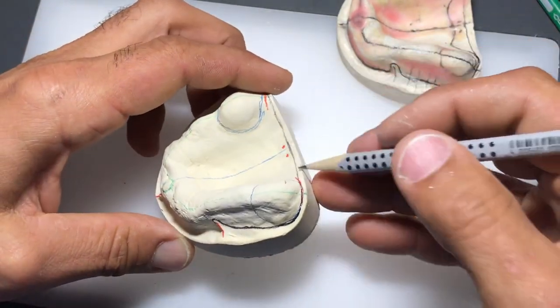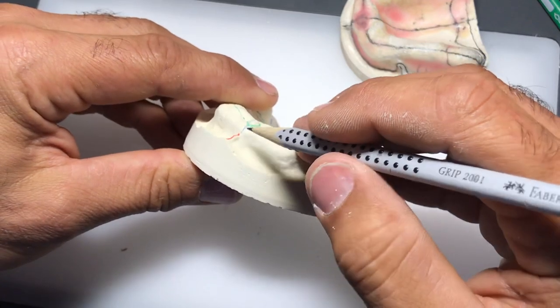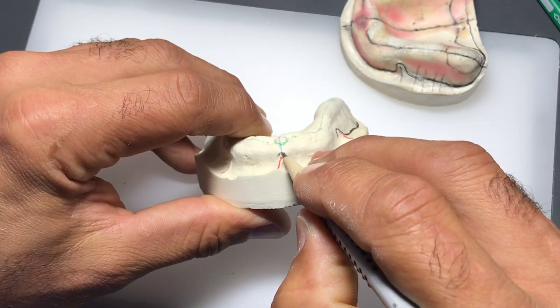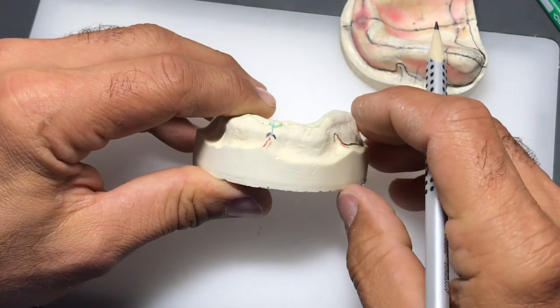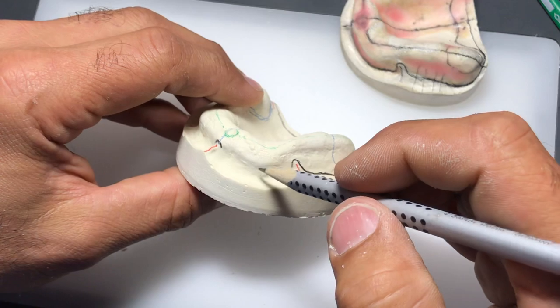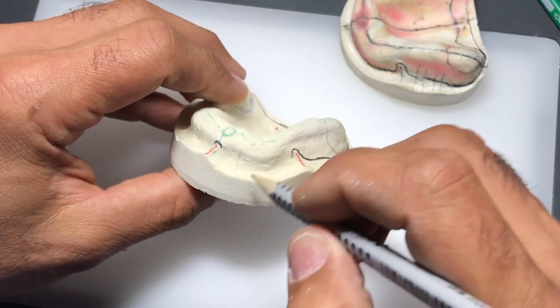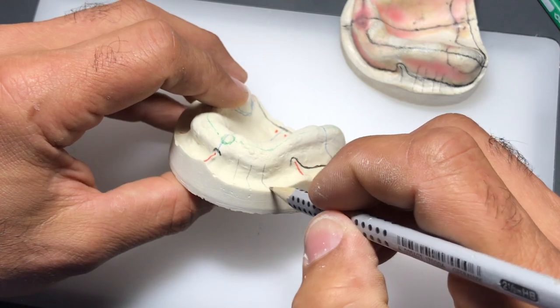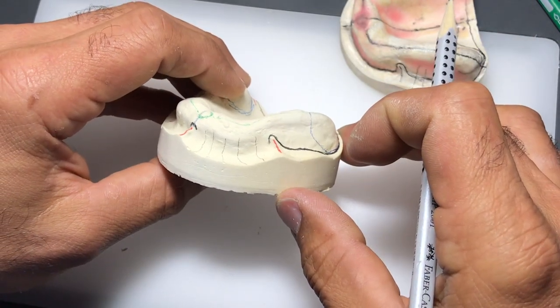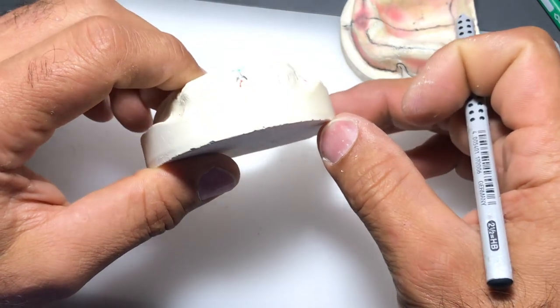That looks pretty good - I'm about a quarter of the way done. I'll continue around the model and start again at the labial frenum, giving myself a millimeter to a millimeter and a half of relief around it. If you're not sure where this line should be, you can make some vertical striations perpendicular to the surface of the cast. When you turn your model over, you can see the deepest point because that's where you have the greatest angle of those striations.